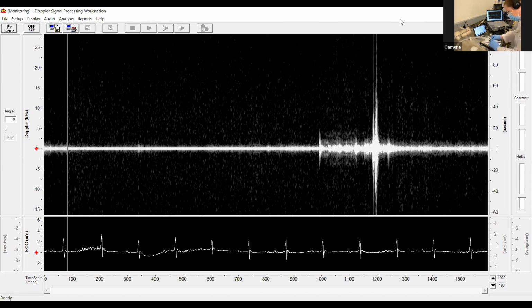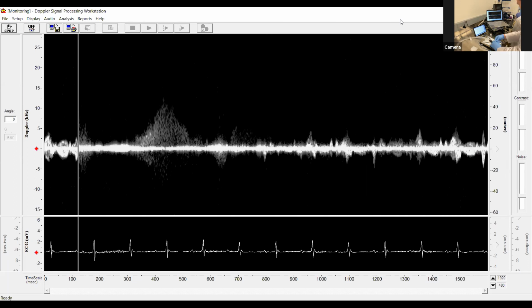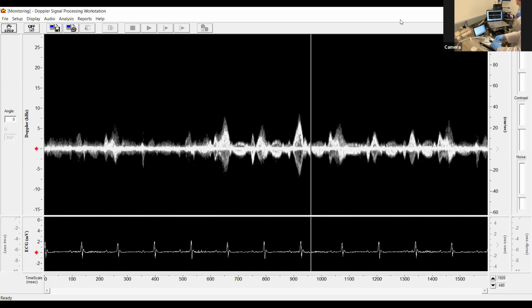Okay. I'm going to say his heart is probably in a different place that we're not used to in the chest cavity.